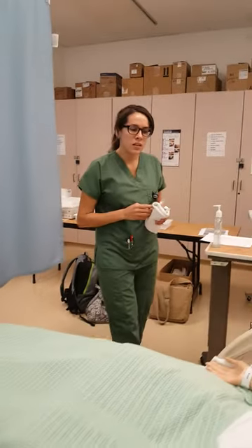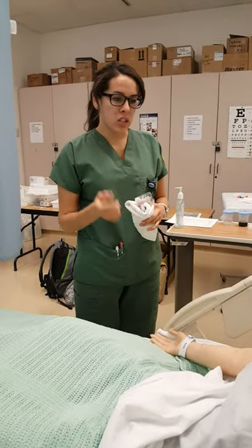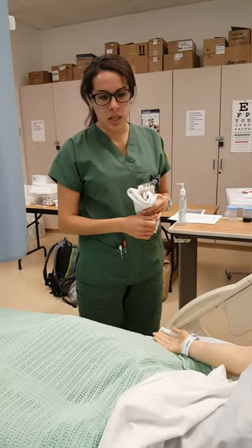Hi Anne, how are you? Good, how are you? Good, I'm Daisy. I'm your nurse for today. I'm just gonna be checking the location of your gastric tube, making sure that it's in your stomach, okay?